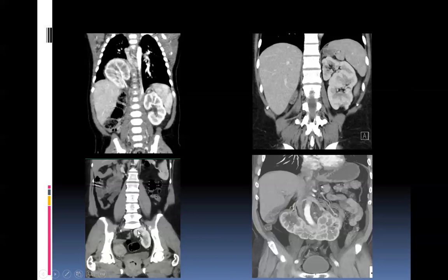In this case, the kidney is lying in the pelvis. So again, a congenital anomaly where the kidney should not be lying in the pelvis. Someone asked me, is it a transplant kidney? Yes, sometimes we do have transplant kidneys placed in the pelvis where you attach the iliac artery and the vein, and obviously they drain into the urinary bladder. But this one is a congenital one, so you'll see absence of the native kidney. You'll not see the native kidneys in cases of congenital anomaly. If it's a transplant kidney, you might see some remnant or an atrophic part of the kidney in its normal location.